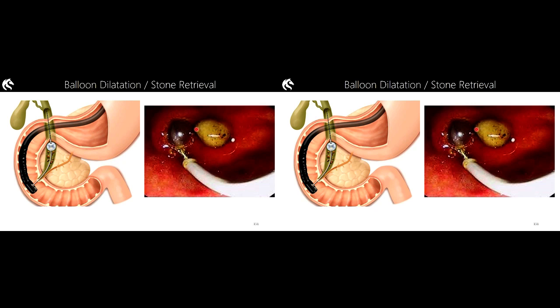The rough rule of thumb goes like this. If it's a rock, we can use a basket. This will all make sense in a moment. And for anything, we can use a balloon. Okay? Rocks need baskets. Anything needs a balloon. That will all make sense a little more in a second. Here goes.